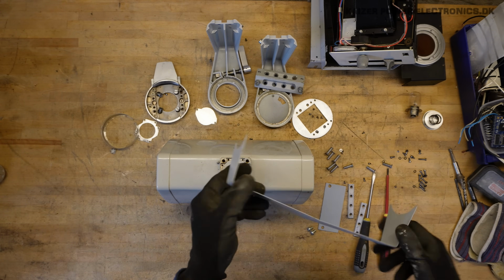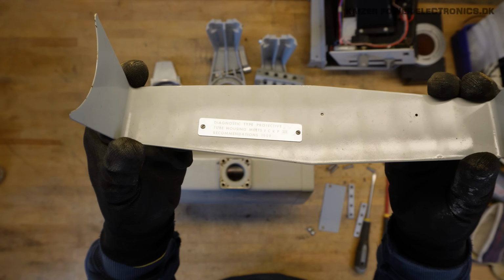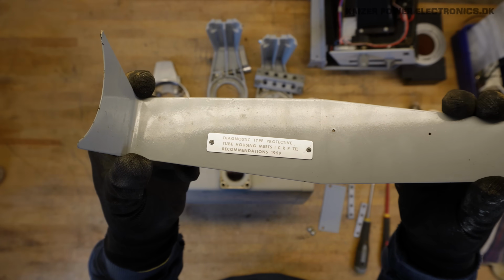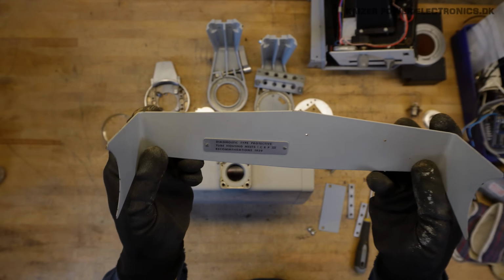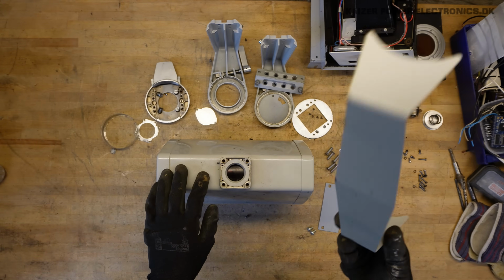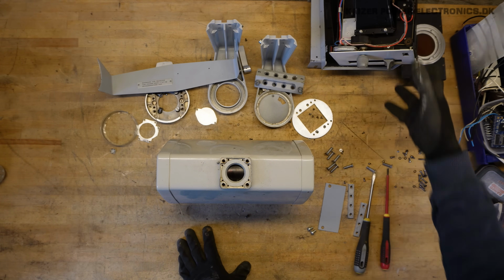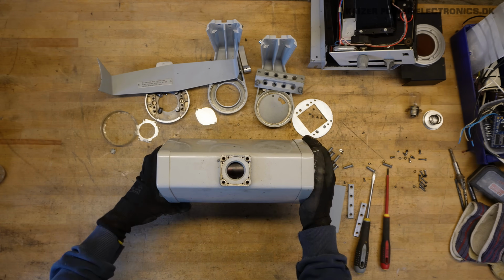And on the inside, we actually have some date marks. "Diagnostic type protective tube housing meets ICRP recommendations 1959." So this is the medical quality stamp that this upholds to the standards of the time. I think there was another stamp somewhere. Was that inside this one?